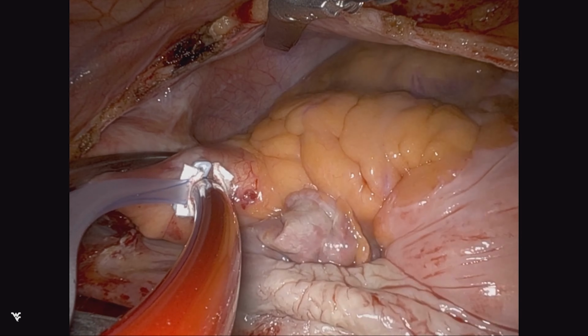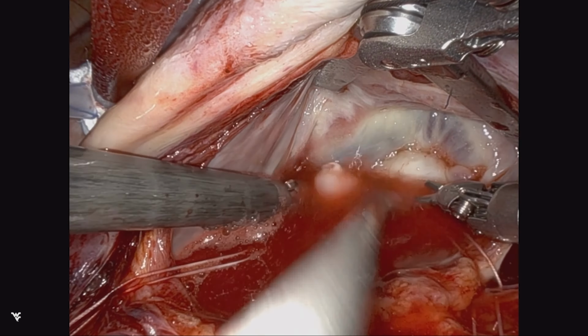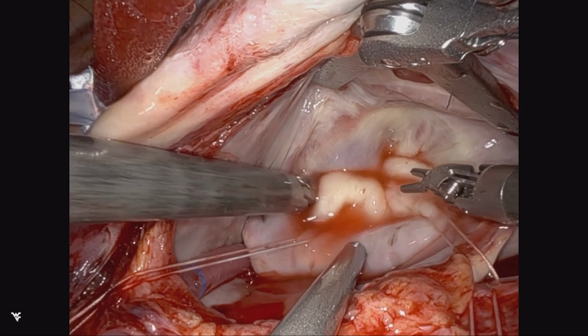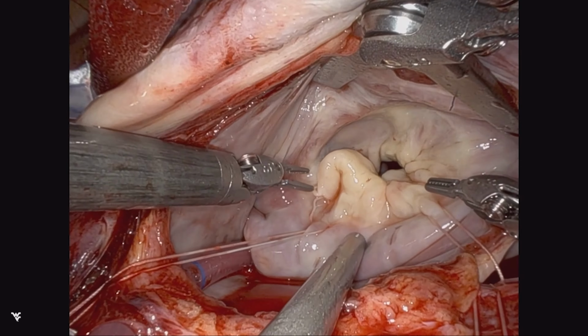Cross clamp was applied, and valve analysis begun. One can see that there is, again, diffuse posterior degeneration. The anterior leaflet is reasonable.